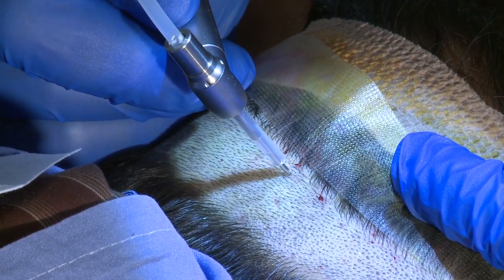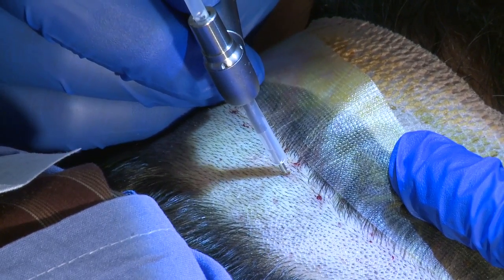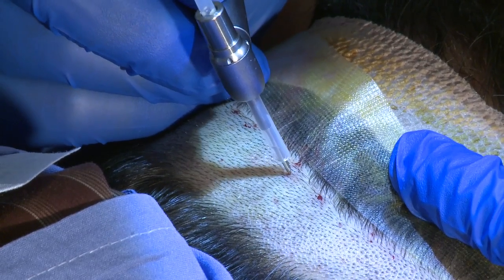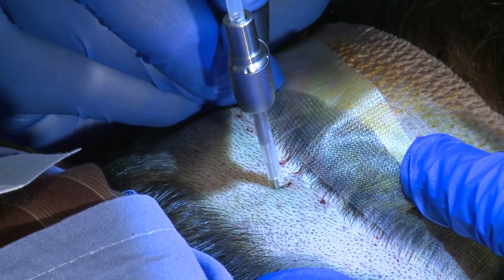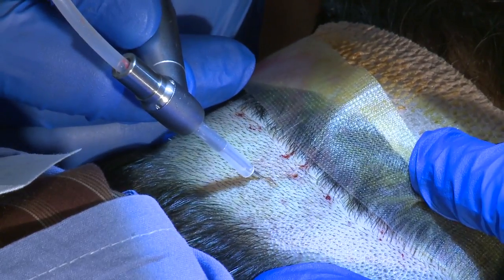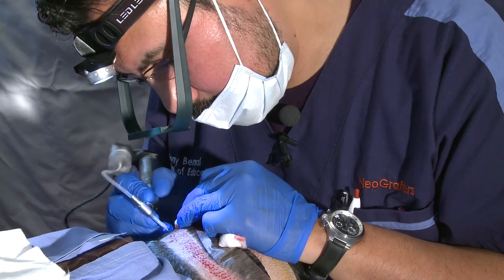The graft has been cored, and because there's constant suction, this graft is now a little bit elevated, but it's not released because it's still attached to the subcu fat layer underneath. So the next procedure involved in obtaining this graft is that I allow the top 1/4 of the graft to remain in the punch, threaded into the punch, and I'm going to lay the graft on the side, and I'm going to do what's called a drag and pull technique. So again, I'm going to try to drag it out. There's the graft actually right there after I've dragged it out. I don't know if the camera can see it, but there's one graft. Okay, I'm going to proceed with the harvesting.